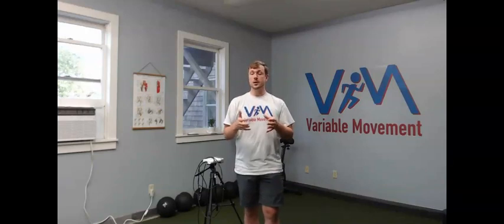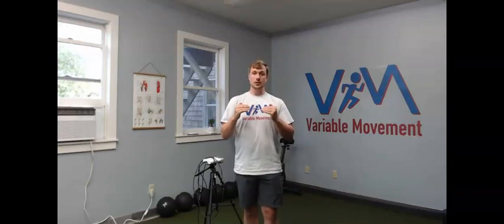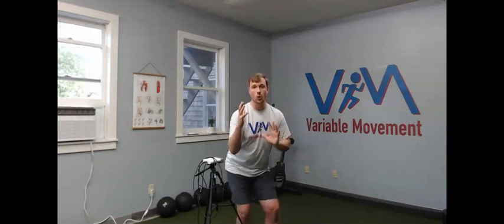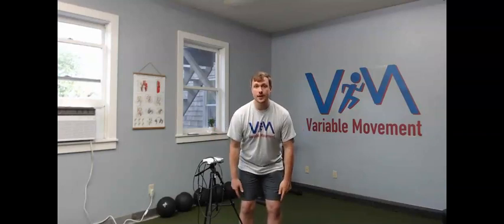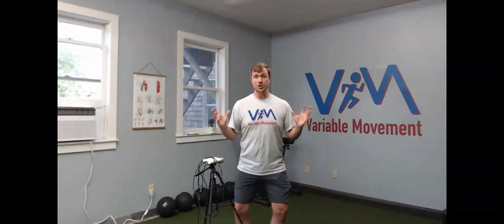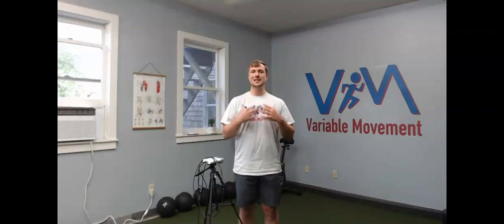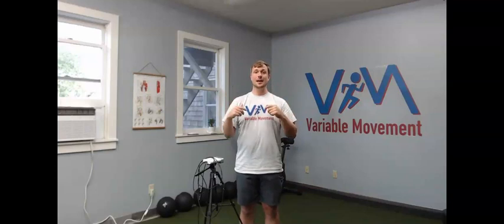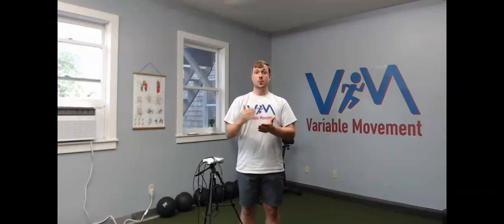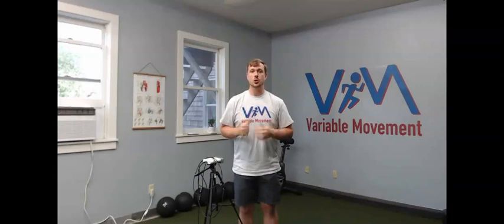Why is this exciting for us? Because we actually get to measure functional ranges of motion in objective measures. So instead of just saying that you're shifting over to the right during a squat, this can actually measure how much hip flexion, knee flexion, ankle movement, rotation is happening in the body all at one time. And so as a clinician, it gives us a ton of metrics. And as a patient or a client, it allows you to actually see in a de-identified avatar how you're moving through space. And then from there, give you an idea of how we're going to move forward in your treatment plan. Here's what it looks like from your end.